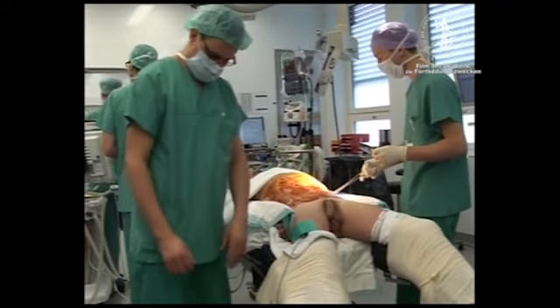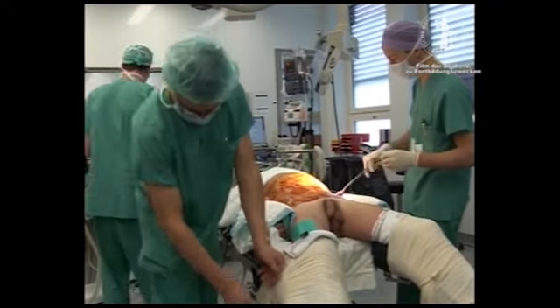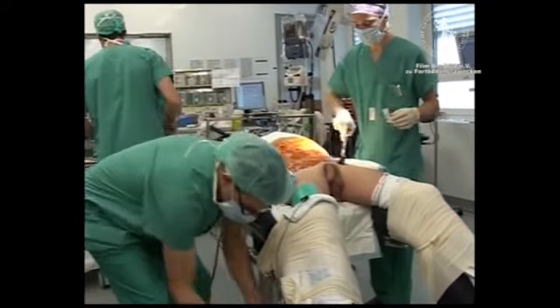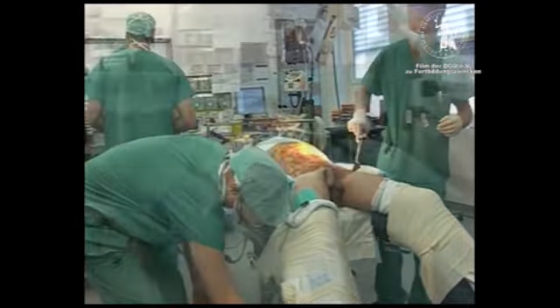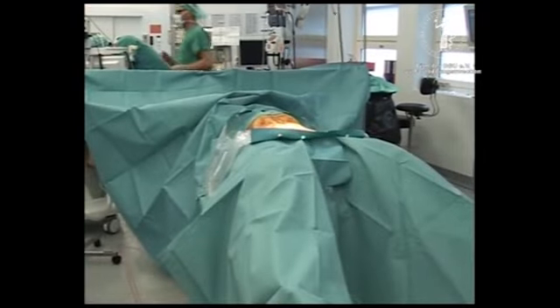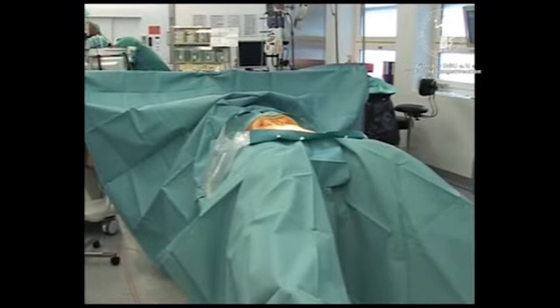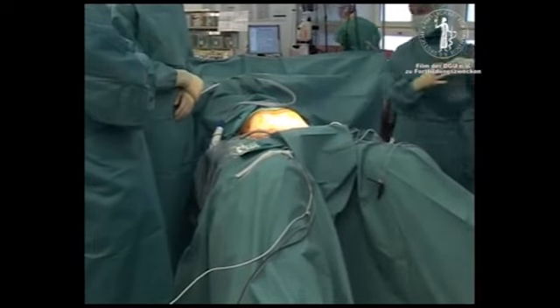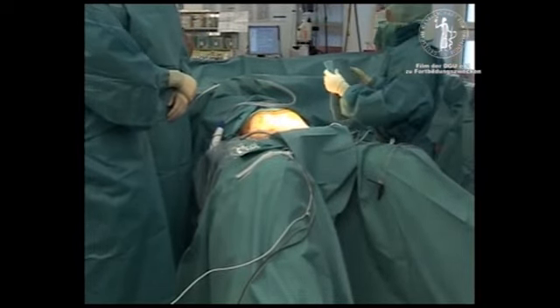Under general anesthesia and full relaxation, the patient is placed in a supine position on the operating table. The legs are slightly abducted and lowered and are fixed into the padded receptacles. The arms are also padded and fixed beside the body. A sterile Foley catheter is inserted after skin prep and draping.